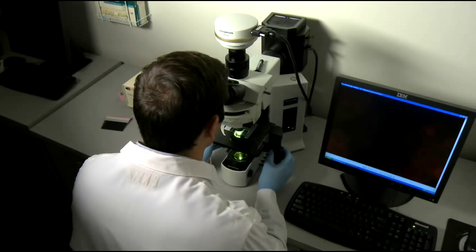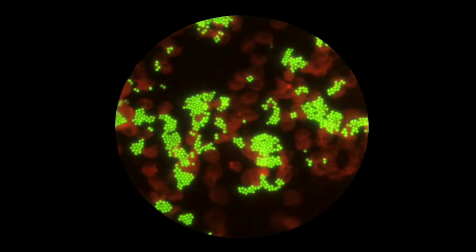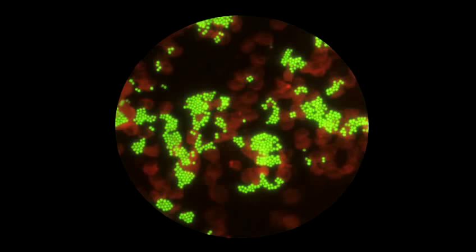Start by examining the positive and negative controls, followed by the sample slides. A positive result is determined by visualization of multiple bright fluorescent cells in multiple fields of view. A negative result is determined by the lack of fluorescent cells.